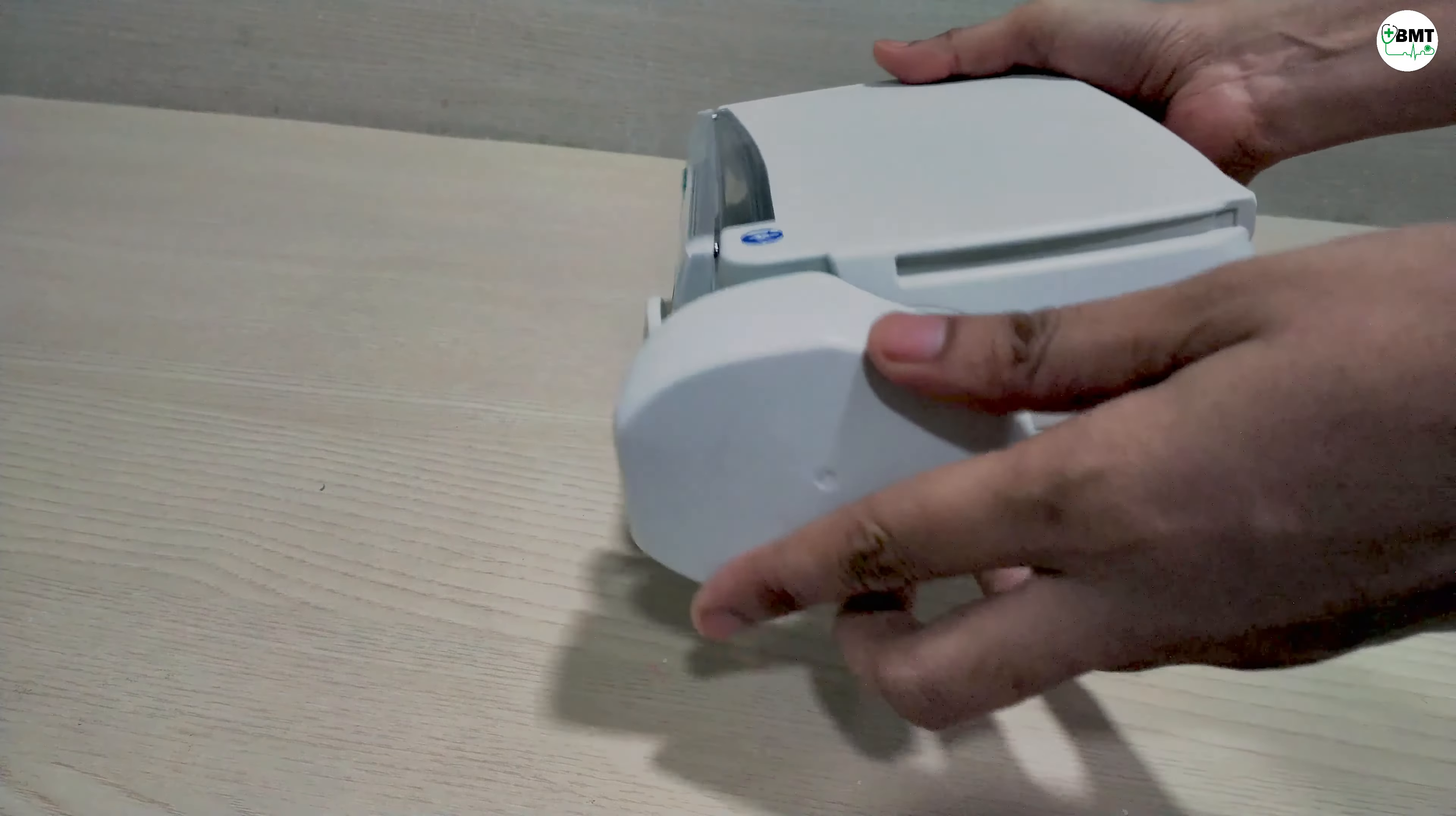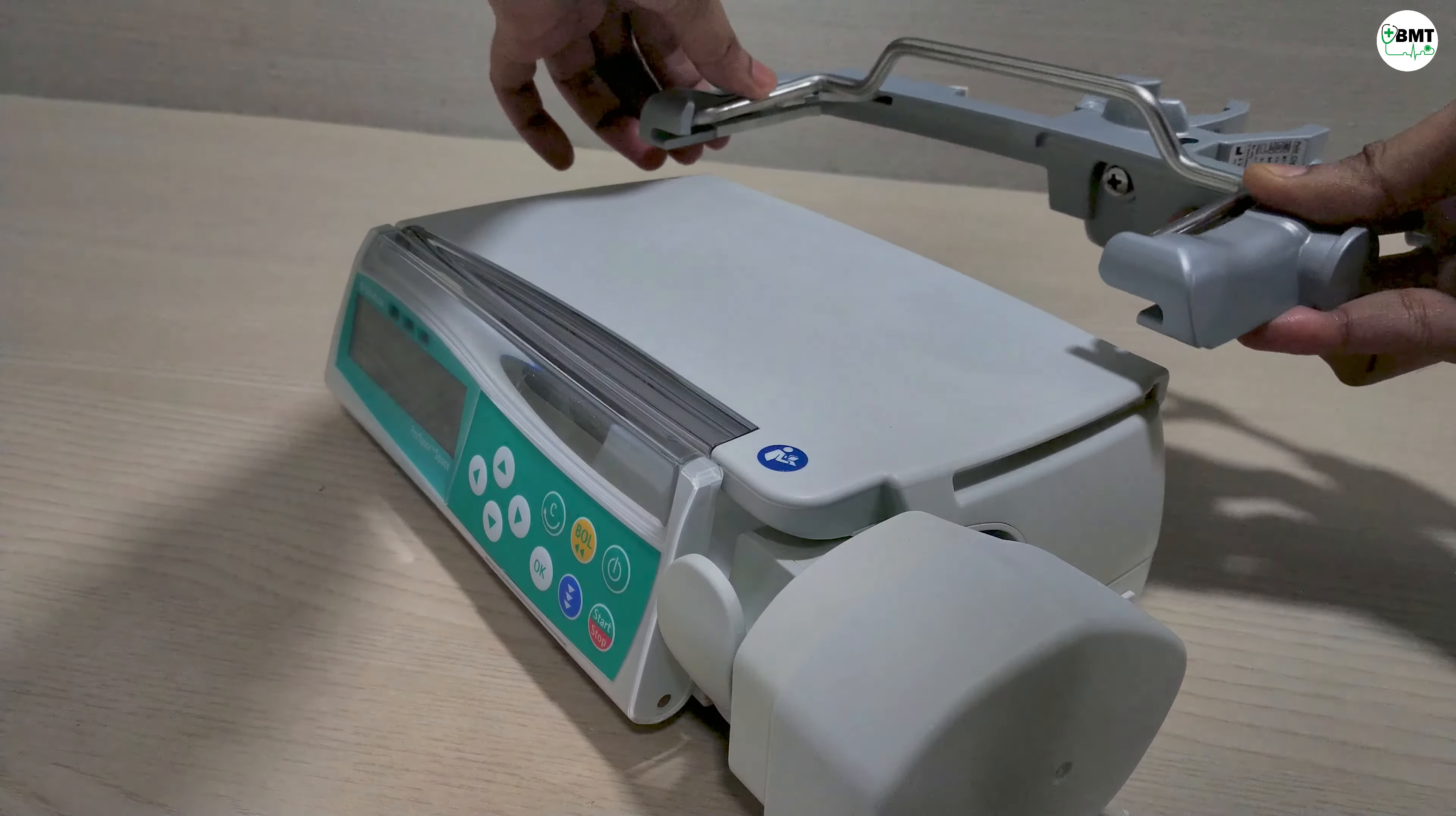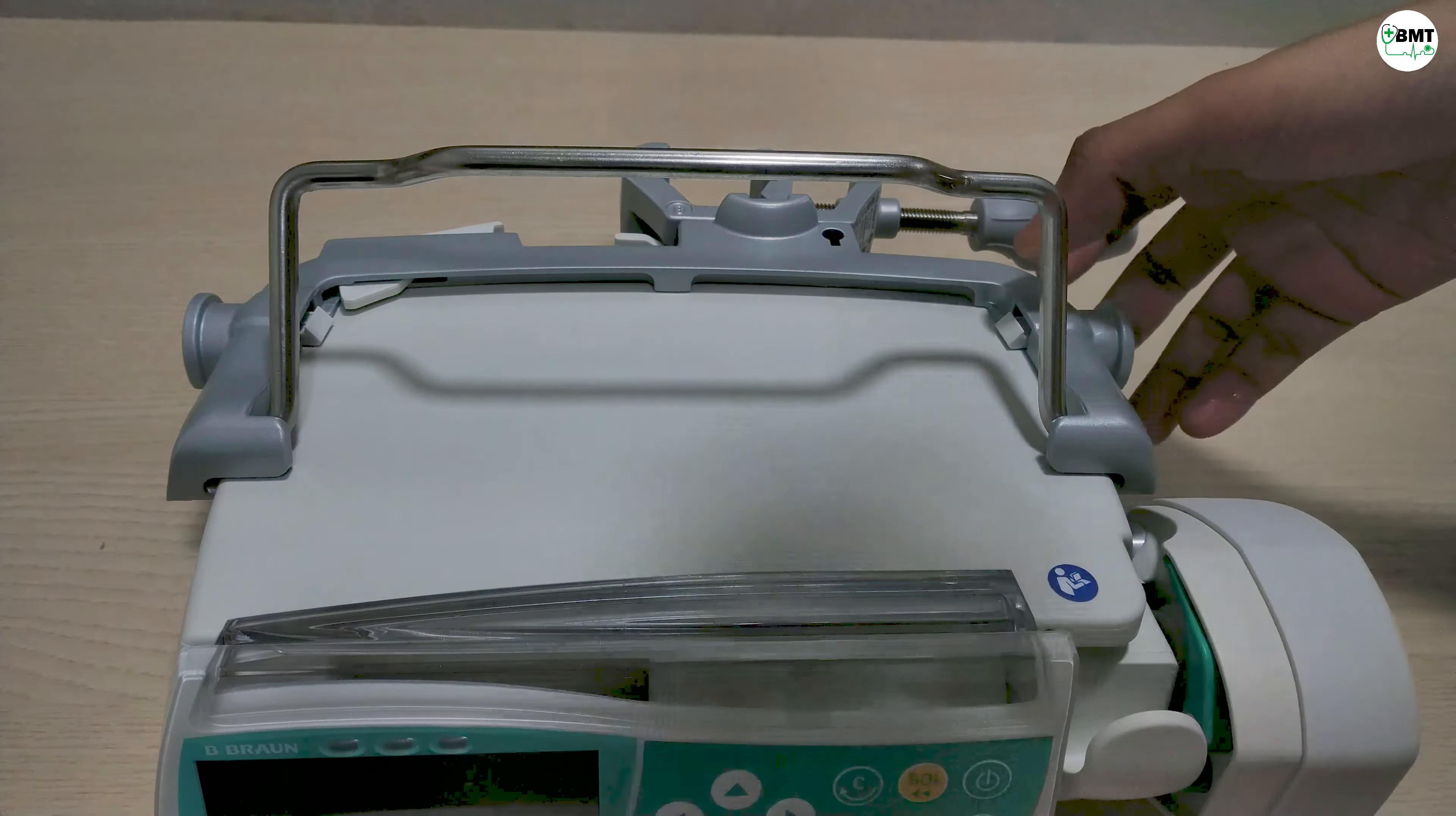Now how to fix the pole clamp. Match this notch. For dislocating this pole clamp, first tilt it up, press this and this notch together.